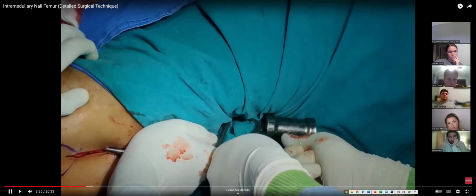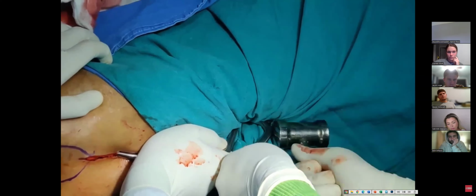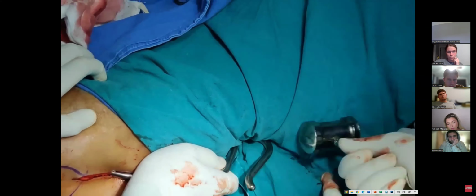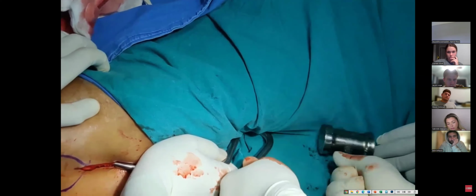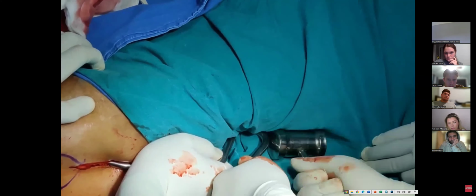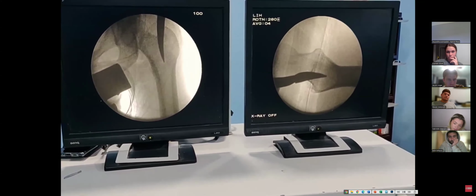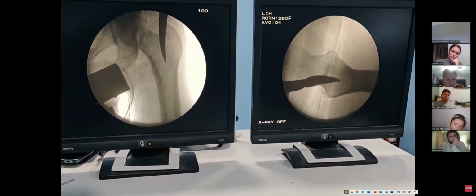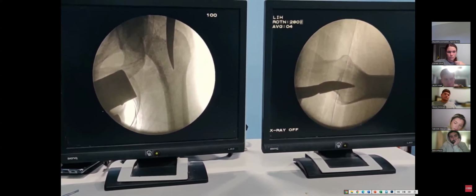Watch this. Rather than twisting with the hand, I would advise you to use a mallet and go slowly with a hammer, because this way it is more controlled and inevitably you will be in the right direction. So I said before, don't twist it. Use a hammer and mallet it. This way you will have much better control.